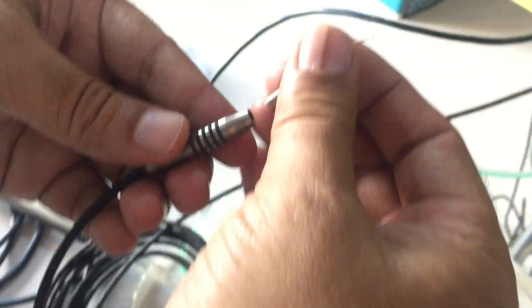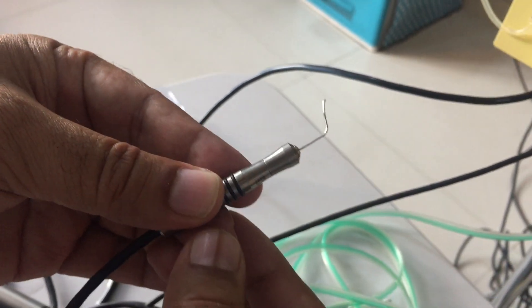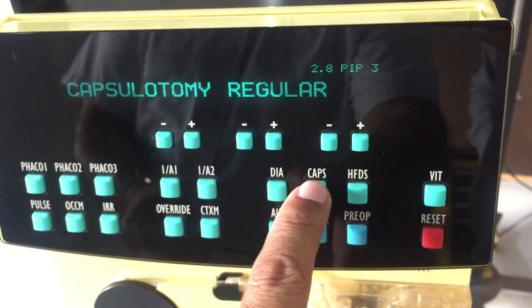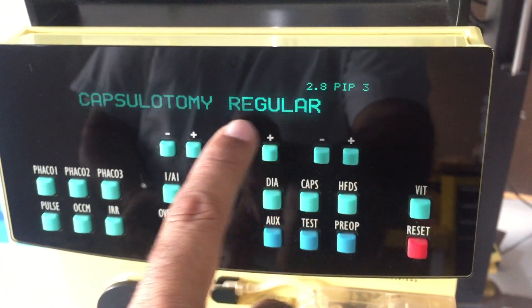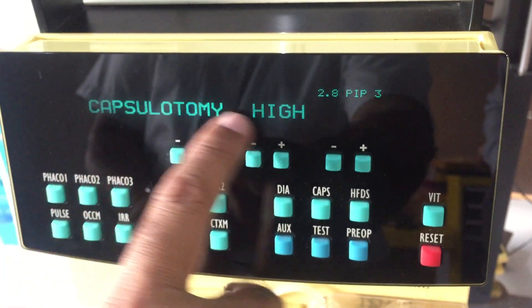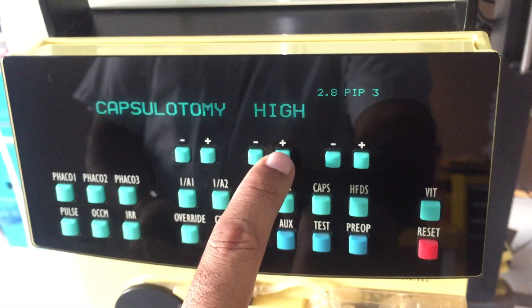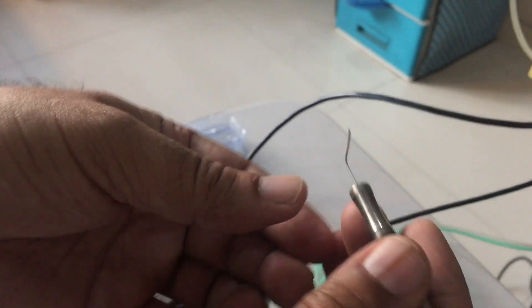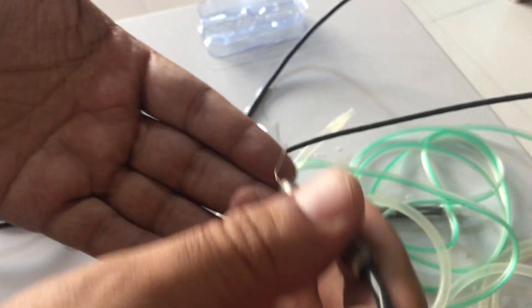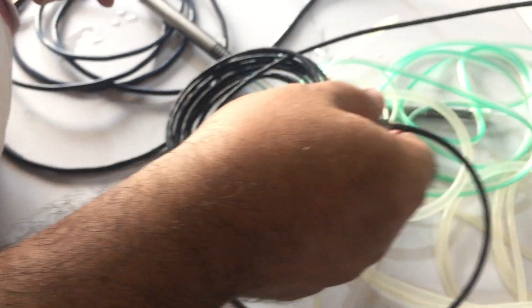If you want to use capsulotomy, mount the capsulotomy tip on the diathermy handpiece and select the 'CAPS' function on the panel. This is the capsulotomy regular mode. You can use the high mode when working on pediatric surgery. Normally it is used on regular mode. Your capsulotomy is ready and you can perform it by pressing the foot pedal.